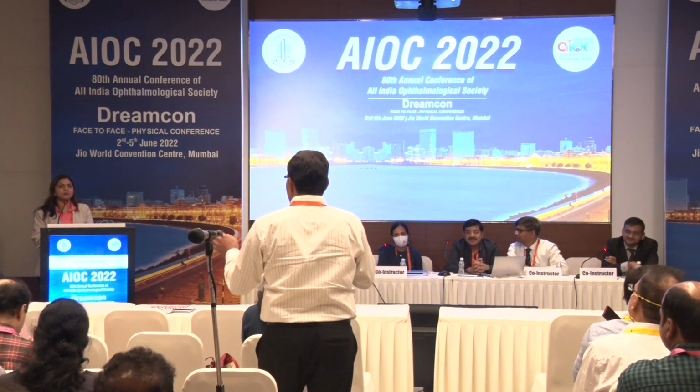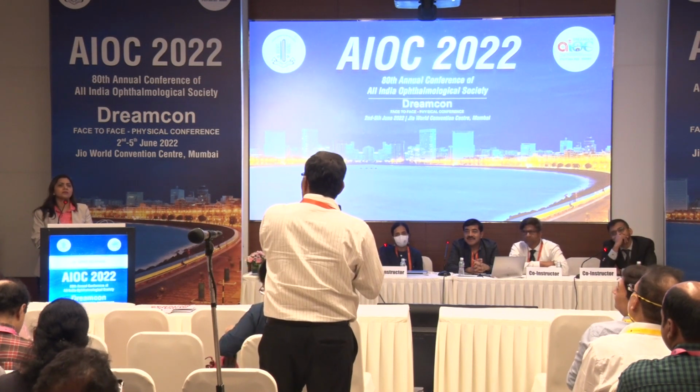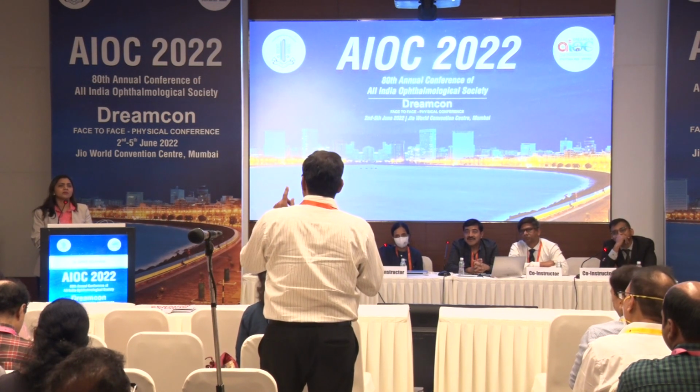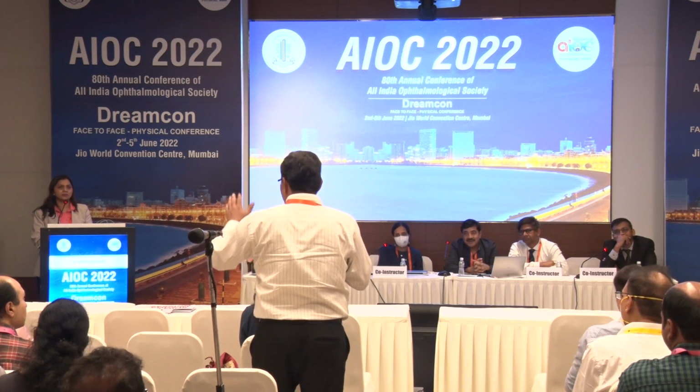I have seen one study, and I have understood that for anterior, Cassini and all are the same. Okay. But for posterior, there are variations in the Cassini and this IOL Master and all the Pentacam.